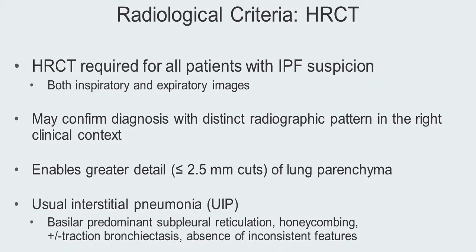The HRCT is required for all patients who have interstitial lung disease where there's a suspicion of IPF. It's typically helpful to get both inspiratory and expiratory images. Expiratory images are helpful to rule out air trapping, which can be seen with chronic hypersensitivity pneumonitis, which is one of the mimickers of IPF.